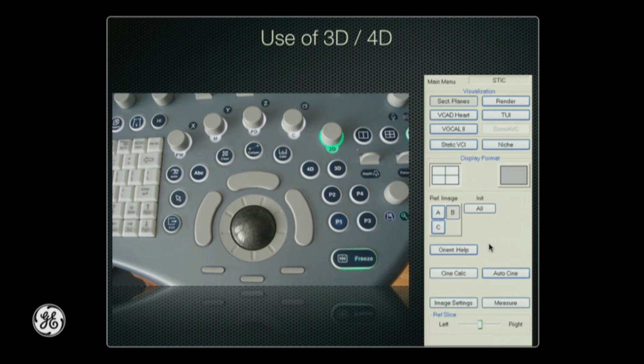And this was the question before the course. How many of you work with the software on the computer? Because you have the three images here and you have all the different buttons on the machine also on your software, and normally you learn on the computer and later you work on the machine.